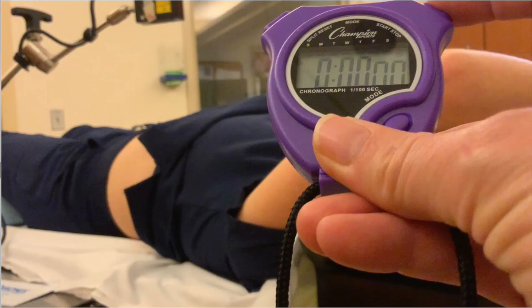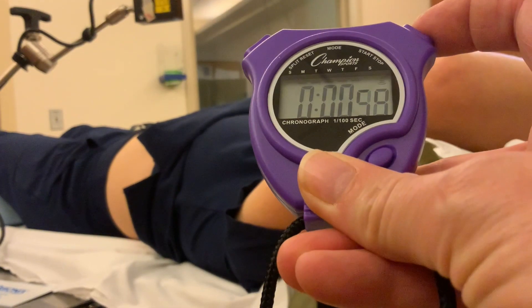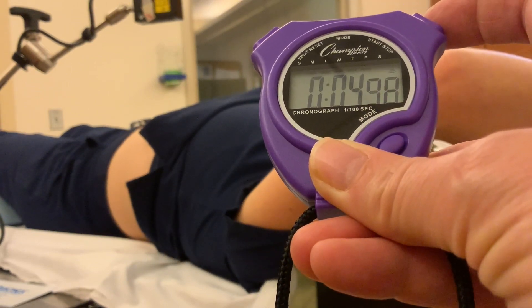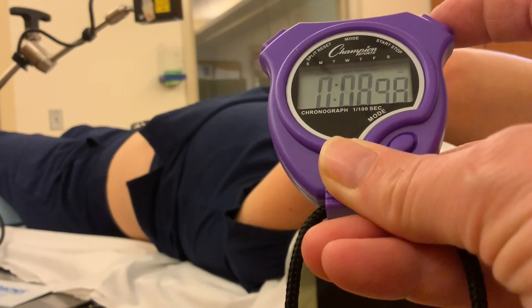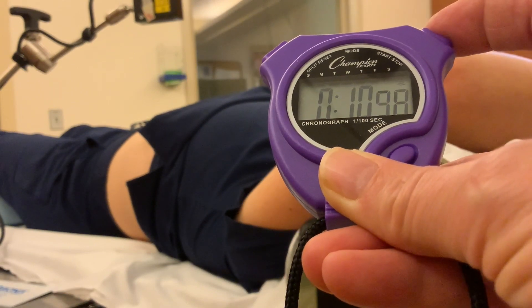Next, we will work with you to determine how long you can hold your breath. Our goal is for you to be able to hold your breath for 20 to 30 seconds. We will work with you until you are comfortable with this process. The goal is to take a deep breath through your chest, keeping your back flat against the table.